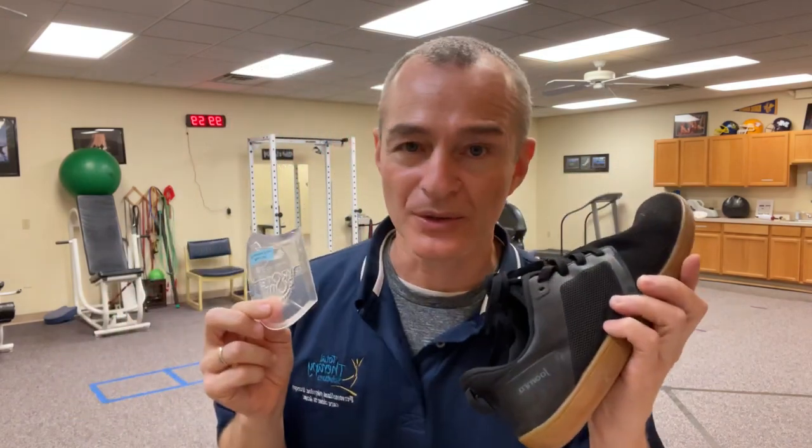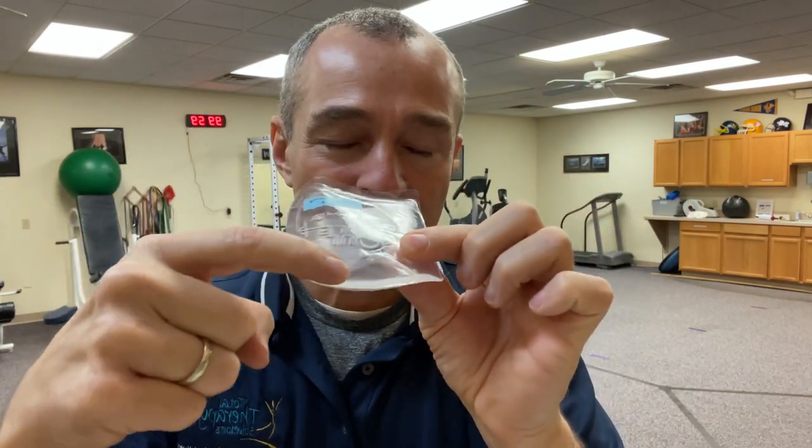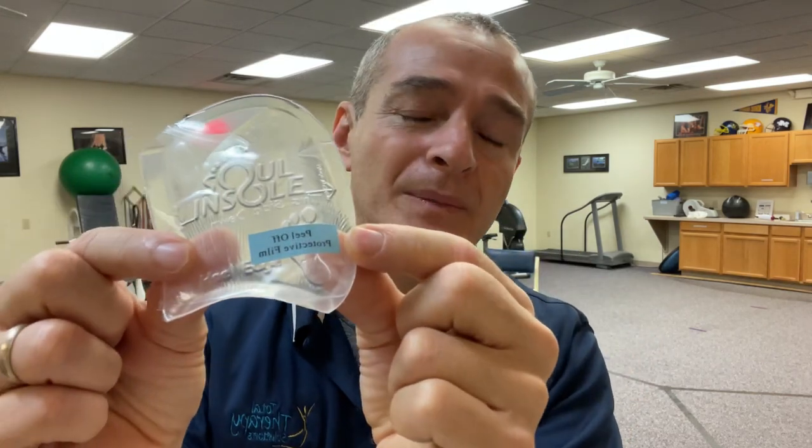Quick tip with this. When I'm using this for the first time with a new patient in a shoe, it's interesting the way these are designed. It's completely flat on one side, and there's a raised dome on the other side. There's a little label here that says 'peel off protective film,' and 'this side down.' So inside the shoe, the dome side actually goes down — where you would think the dome side would go up because that's what's lifting the arch. But putting it down allows the foot to sit on it more comfortably.